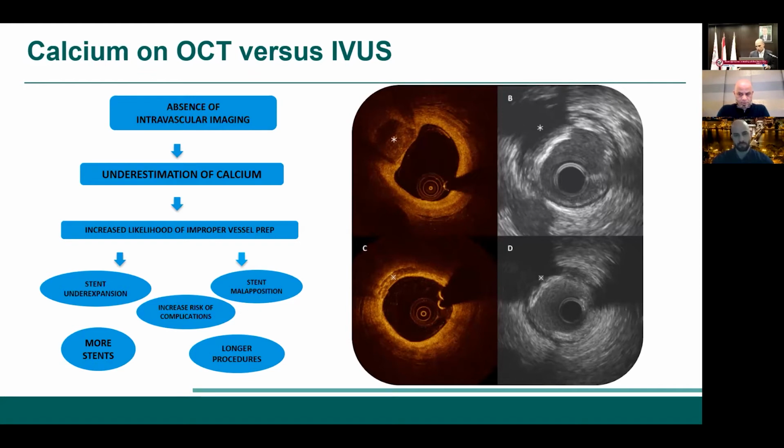These are two chunks of calcium. You can see on the left OCT, optical coherence tomography, a light-based imaging modality in which calcium has a low attenuation and low backscattering with sharp edges. So you can see light going through it. You can see my asterisk in the upper left corner there. Corresponding to that, we're maybe more used to IVUS, which has been there since the 80s, while OCT has been around 10 years now, since the FDA approval. But you can clearly see that hyperechoic signal and some shadow behind it. These are the signature of calcium.